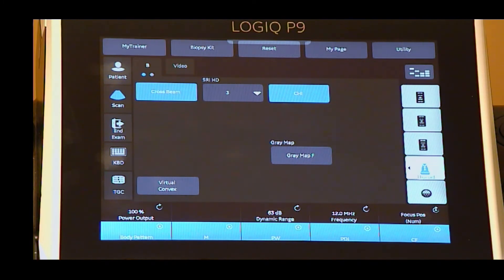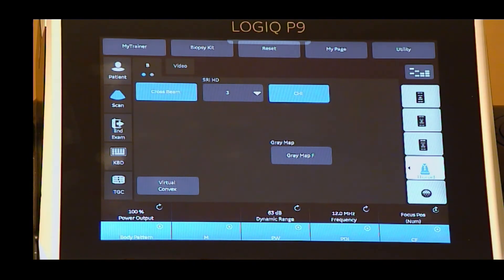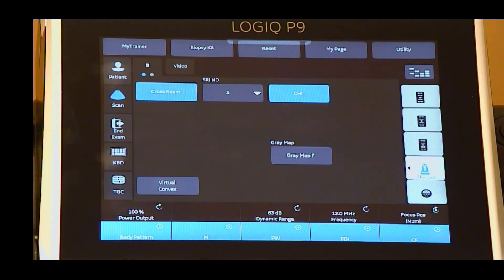Power output adjusts the acoustic power level. Dynamic range controls how echo intensities are converted to shades of gray, increasing the adjustable range of contrast. Increase dynamic range for more shades of gray and decrease for more contrast.